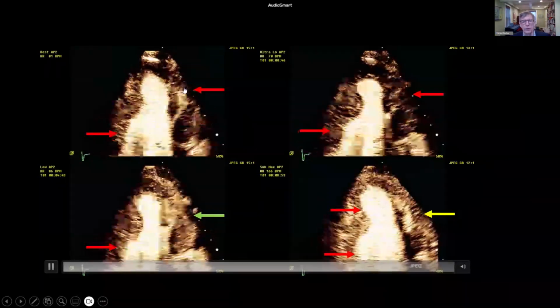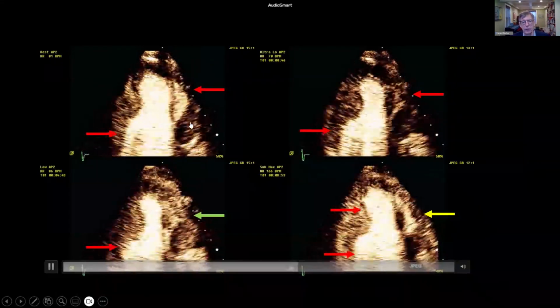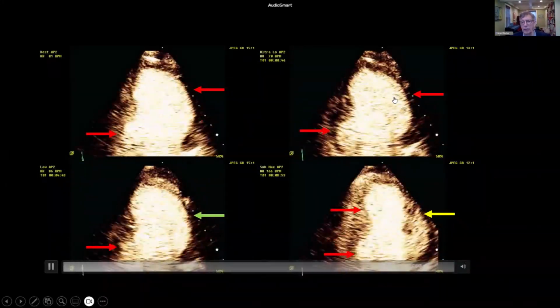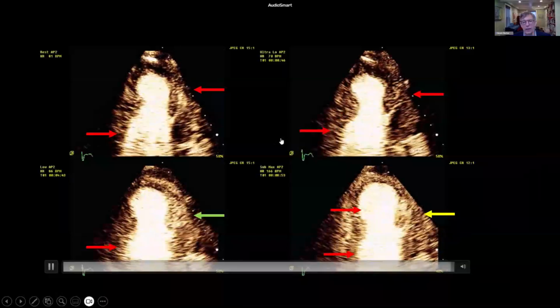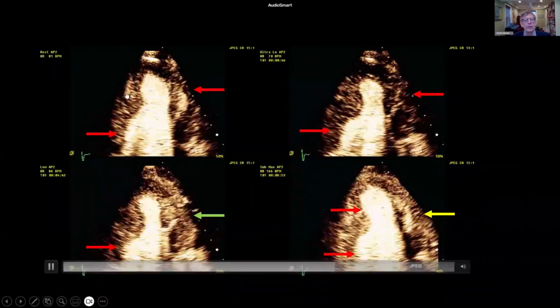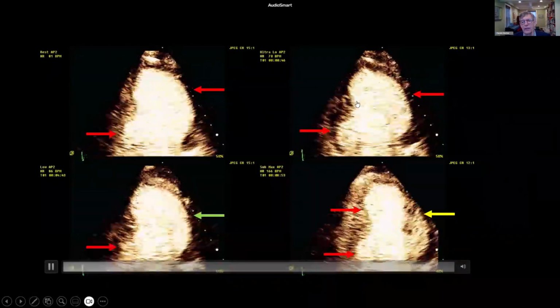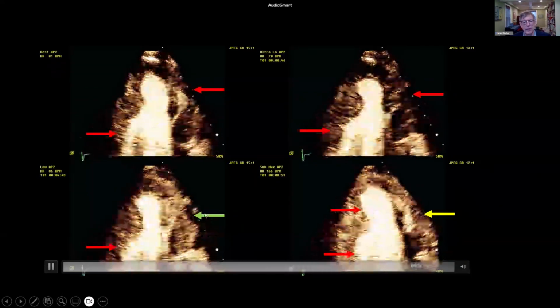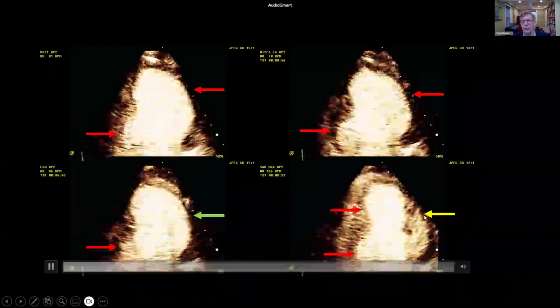Apical anterior wall is good. And we see here an akinetic mid-segment of the anterior wall, and then the basal wall is normal again. And you see that not much has changed. We have some augmentation here at low level, and now you see what's happening at intermediate. We did the intermediate because when you look at the heart rate, there was not much change. It actually was a little bit lower here at 10 mics. So we did 20 mics recordings, and sometimes that's necessary. What you can see nicely here is how the anterior wall augments, and also the mid-anterior segment, which again gets worse at peak stress.